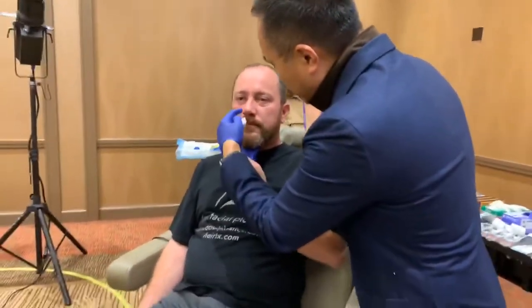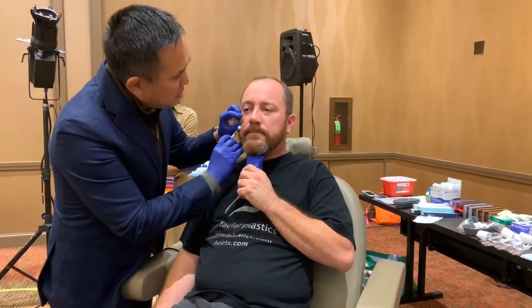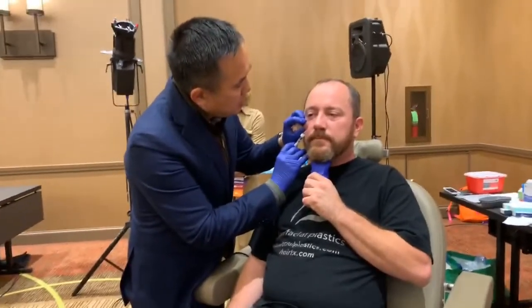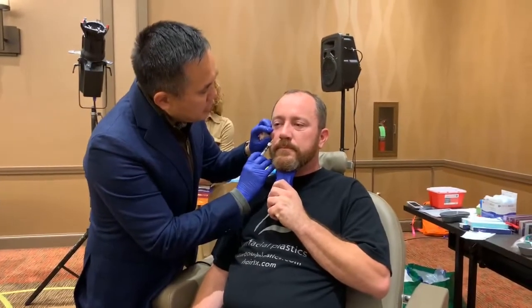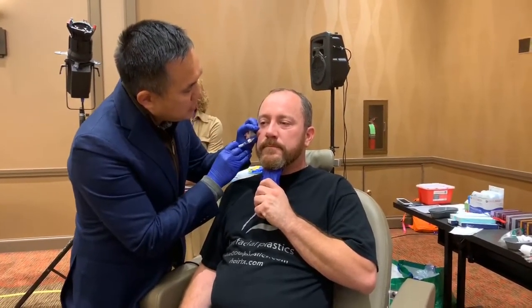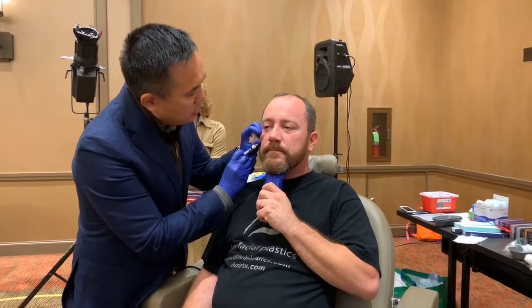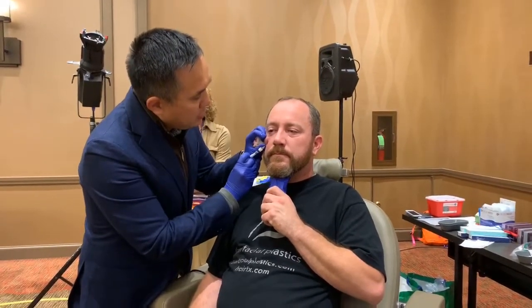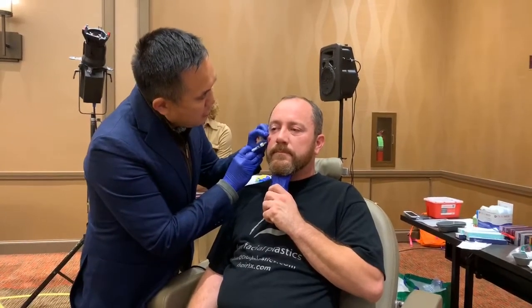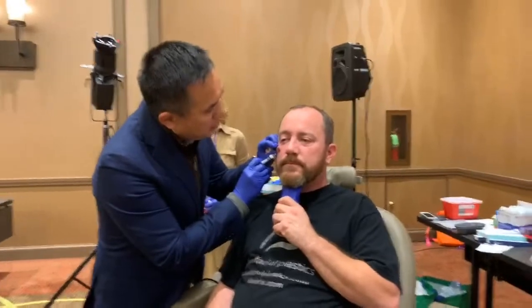We've used almost a full CC and you can see the improvement. I'm in just the subcutaneous plane — there are a lot of different arguments about this. Some people argue that going subcutaneous creates a higher Tyndall effect; others say going sub-muscular causes problems with clumping down the line. I don't think there's an easy answer, but I try to go to the closest point so I'm not hugging the dermis — just in the subcutaneous plane, not really sub-muscular. My assistants are trained to look for deficits I miss. I realized I missed the medial aspect, so I went back over there.